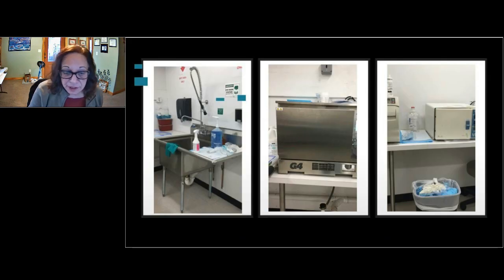This is another example of an area I went to see, a practice. When you walk into the room, on the right-hand side was their dirty area. This was the scrub sink, if you will, where they would clean their instruments. They had a small countertop with their chemicals. Then to the right of that was another wall where they had their washer. And then across the room on the left were their sterilizers.